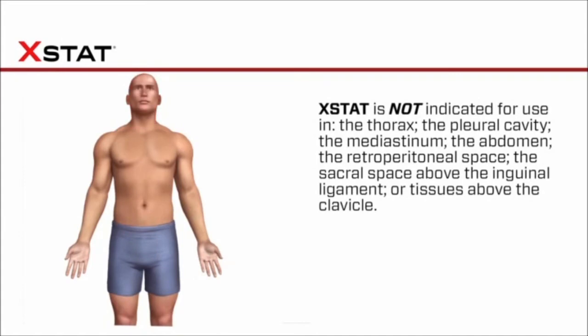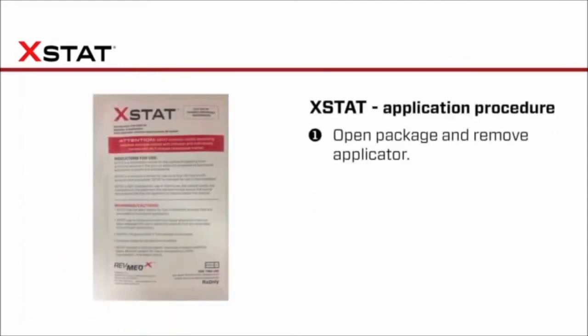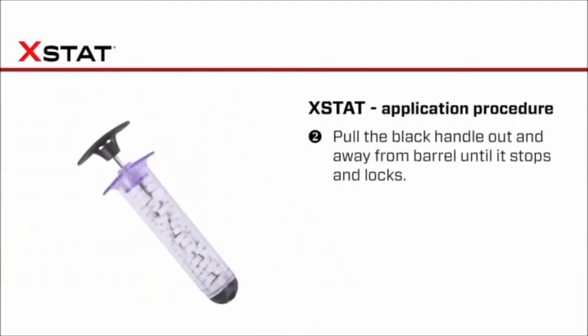XStat has not been tested for use in extremity wounds that are amenable to tourniquet application. XStat use in conjunction with tourniquet application has not been assessed for use in extremity wounds that are amenable to tourniquet application. Application procedure: open package and remove applicator.